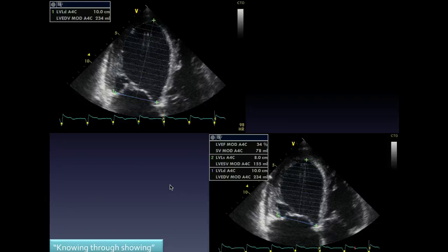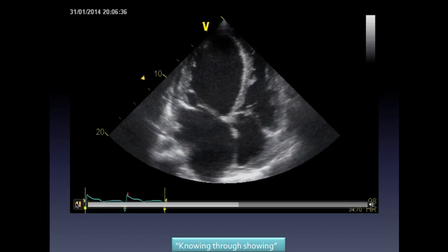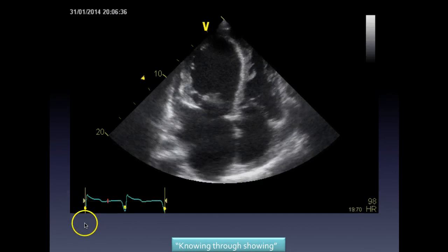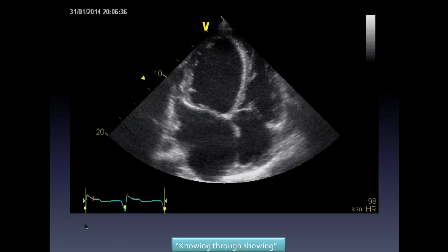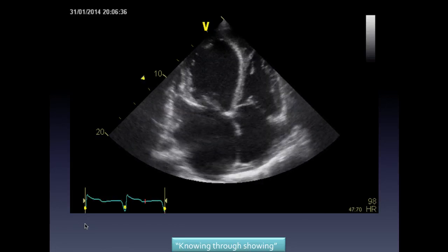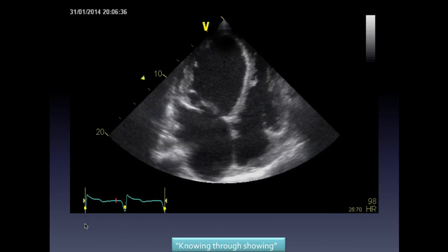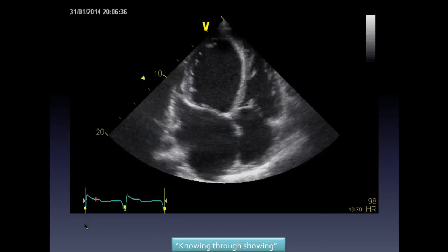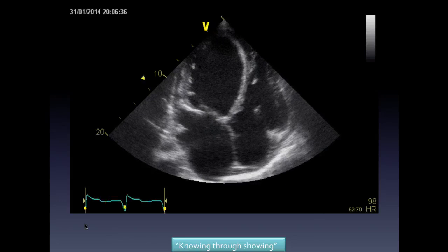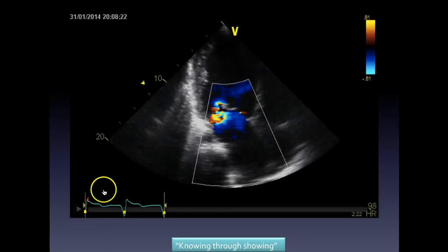And I just think that's a particularly good shot for a few reasons. Firstly, that kind of vigor you see in contractility is movement of the heart, it's not thickening. Okay? So you could be fooled into thinking that his ventricle is a little bit better than it is. Secondly, I didn't tell you if he's on an inotrope or not. You didn't ask, did you? Thirdly, the right ventricle is extremely important, and I just wrestle with the right ventricle the whole time. But you get the sense here that even the right ventricle ain't so good. The left atrium is huge, okay? And there's something else on the next slide, I think, that will show it.